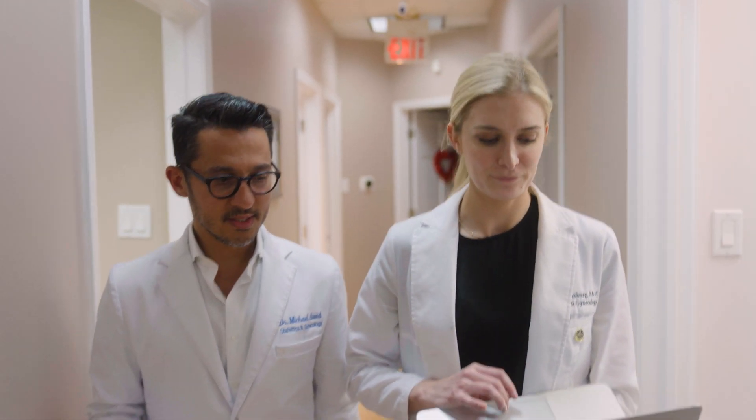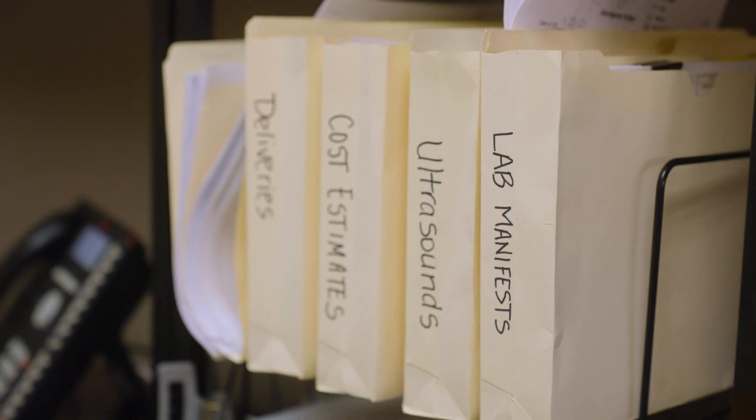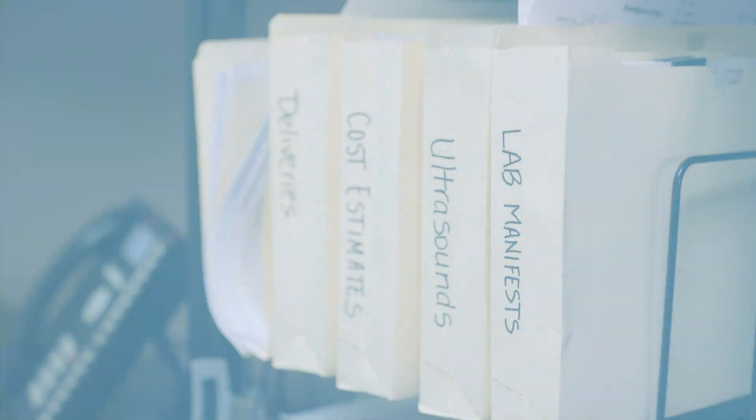Abbey comes in three different sizes. Regardless of the patient's body mass index, we're able to use each Abbey tailored to each patient. We don't have to think about whether this patient is a candidate for Abbey or not — it really is just part of our post-operative care.